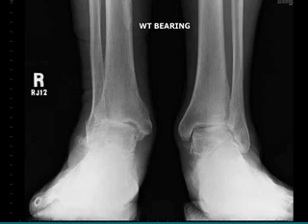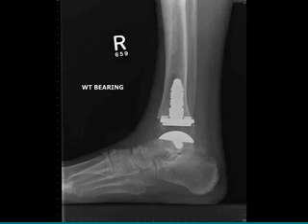Let's look at this 73-year-old male, right ankle pain for 2 years. Again, he has a valgus deformity, but you can see there's no avascular necrosis there. There's a nice homogeneous integrity to the talus. Now, at the time of his INBONE ankle, I think you can criticize this and say that there was a little bit extra bone taken off the posterior aspect of the talus, and indeed, I certainly try to leave more talus now and try to get that flat cut across that area.